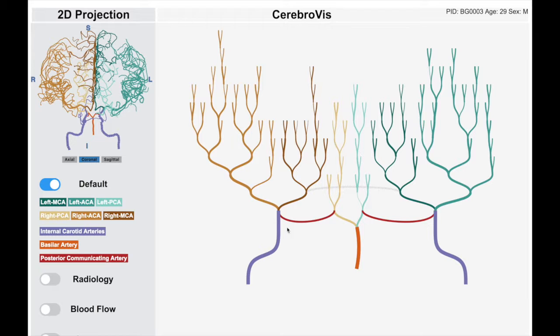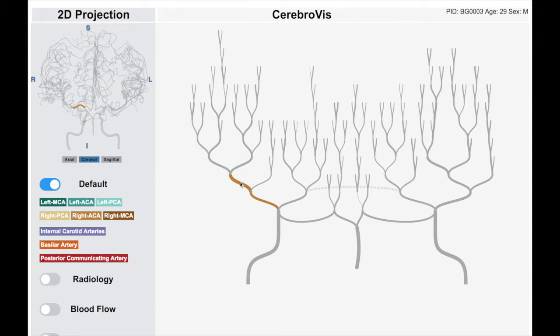Here you can see that the arteries are roughly positioned according to their position in the real human brain.